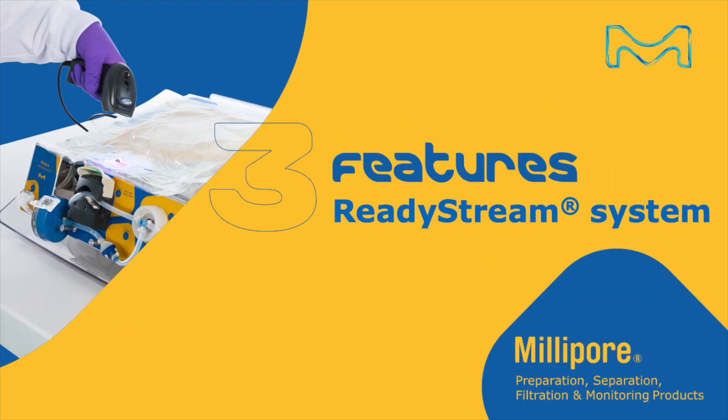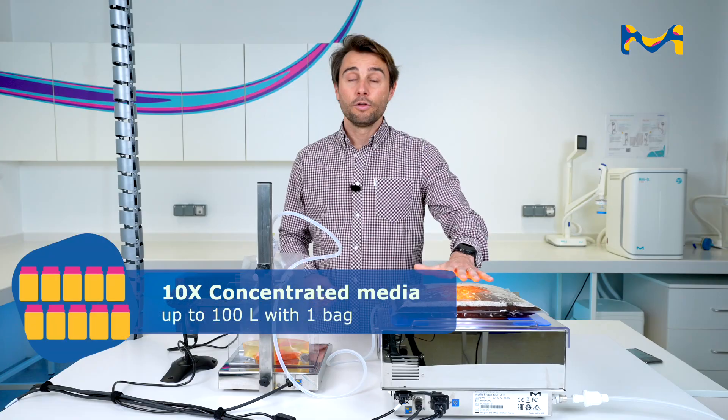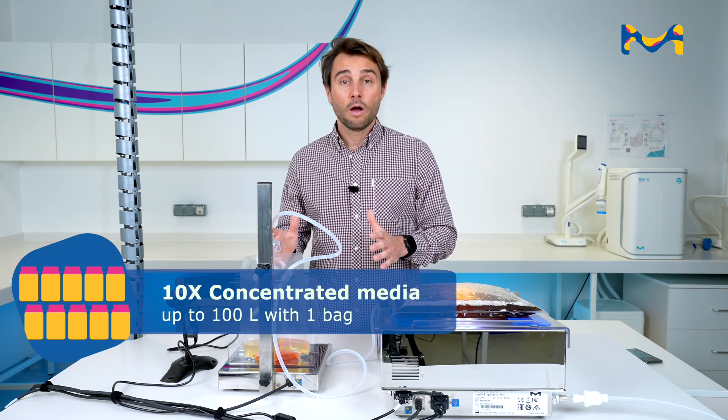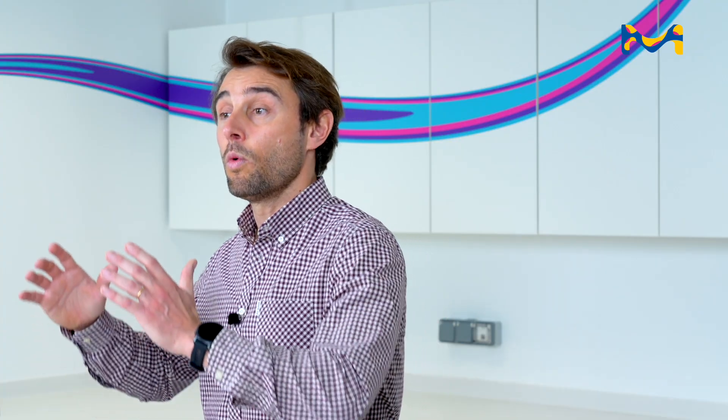So three features for ReadyStream. The first one, as I mentioned, is concentrated media — 10 times concentrated media. So with a bag of 3 liters, you can do up to 30 liters of buffer peptone water. With a bag of 10 liters, you can do up to 100 liters of buffer peptone water.